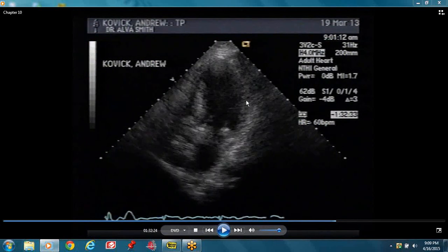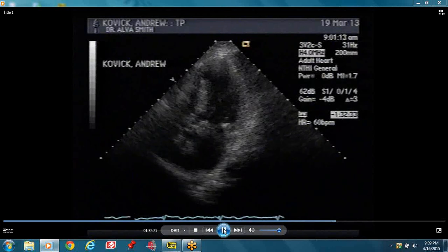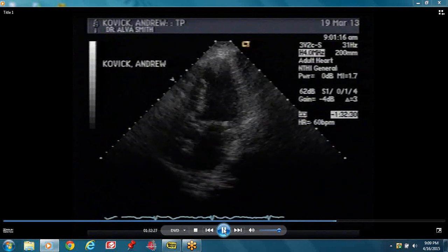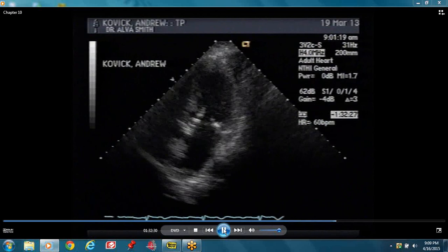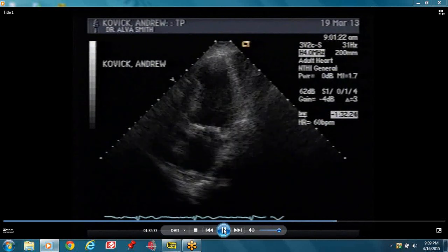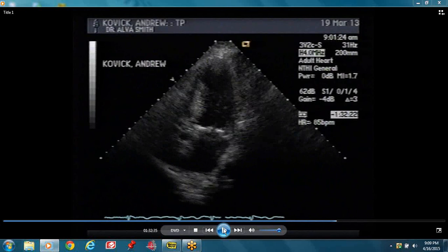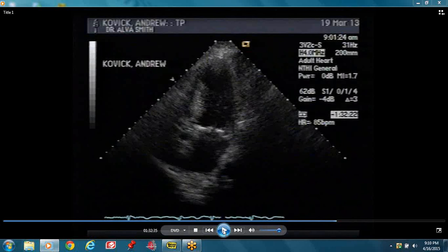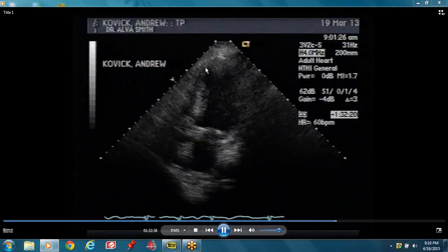This is our apical four chamber view — look right up here. You can see it's not thickening. In the parasternal long axis I spoke about the inflection point — it is the junction between this area which is not moving well and this area which is moving, and that's what gives you the inflection point. Once you look at a lot of these studies, these things jump out at you. If you look up here, it's not thickening — you can't look for motion only because it might have good motion but not be thickening, and thickening is the most important thing.